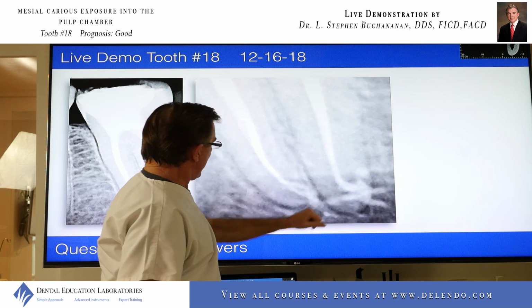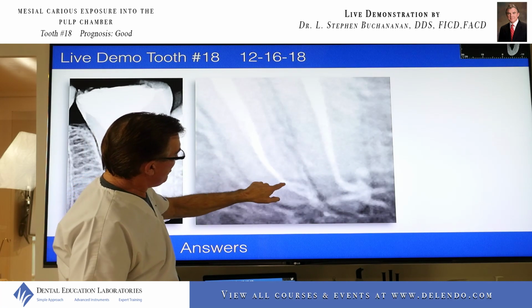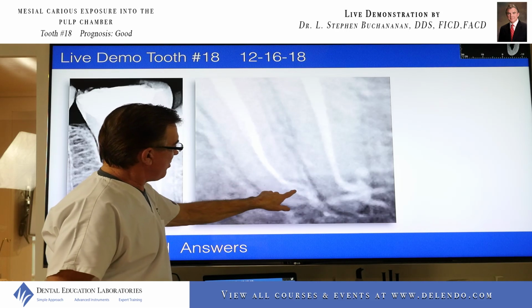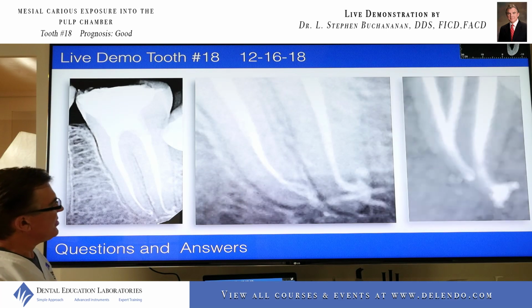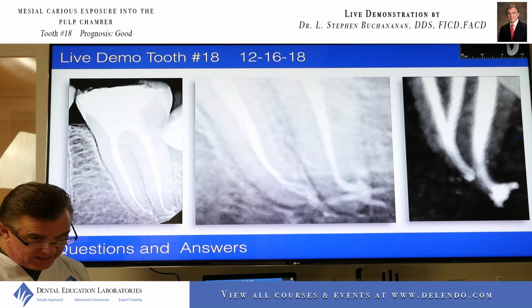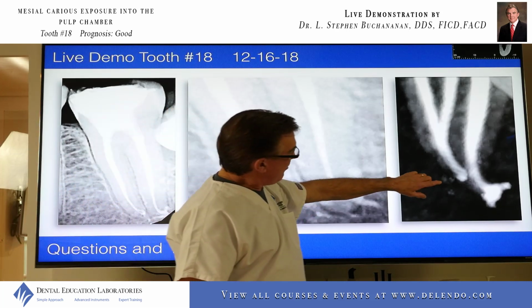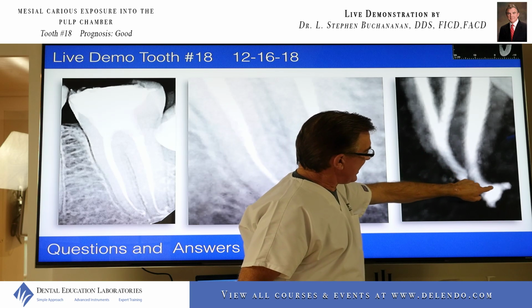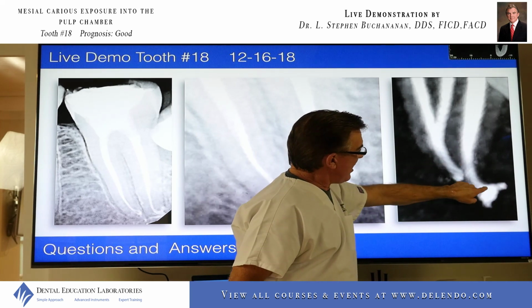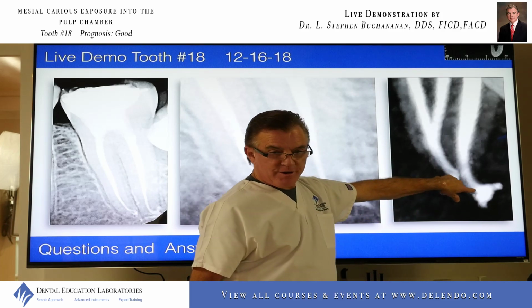This is a lateral canal. The mesials came down and joined, and we see two openings here. A primary opening, which is easy to see. This one on the side is really tough to see in the mesial CT view. Here is a side view. This is actually a 3D reconstruction. You can see especially nicely this distal root and the canal in it, making about a 110 degree curvature, and the lateral canal is coming right off here.